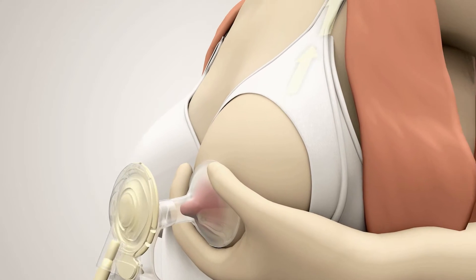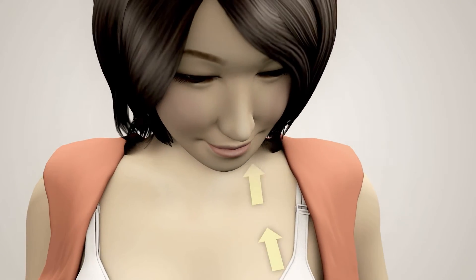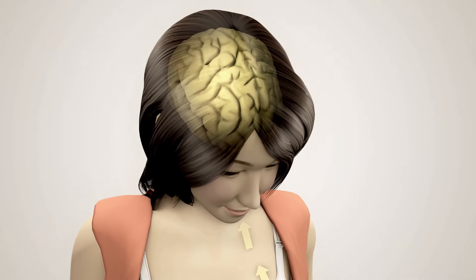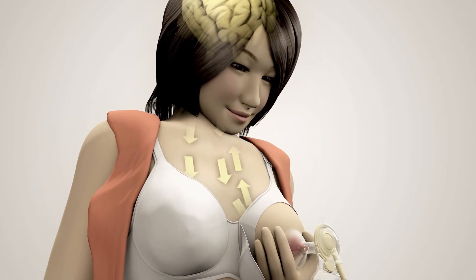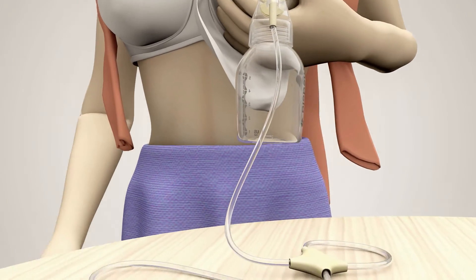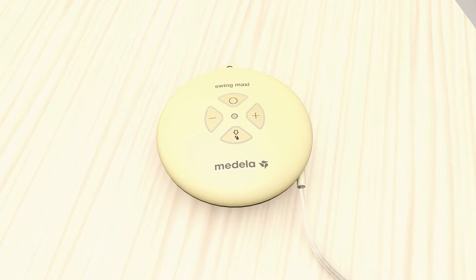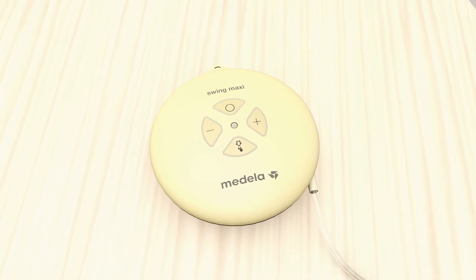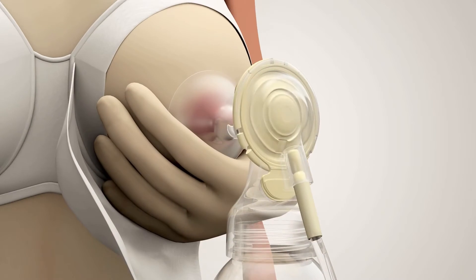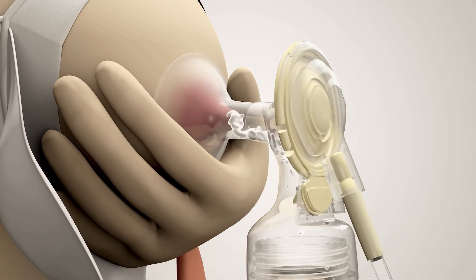The pump starts with more than 100 cycles per minute in the stimulation phase. This fast pumping leads to a release of oxytocin, which triggers the first milk ejection. As soon as the milk starts flowing, it is important that the mother presses the letdown button. This is normally within one to two minutes, but can be different for everyone. The pump then switches into the expression phase, using a slower pattern.